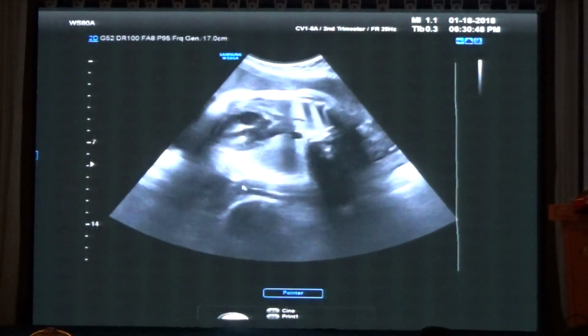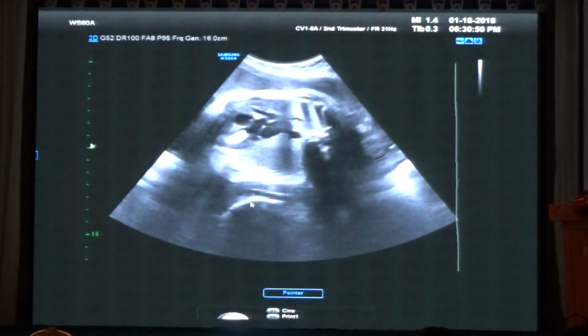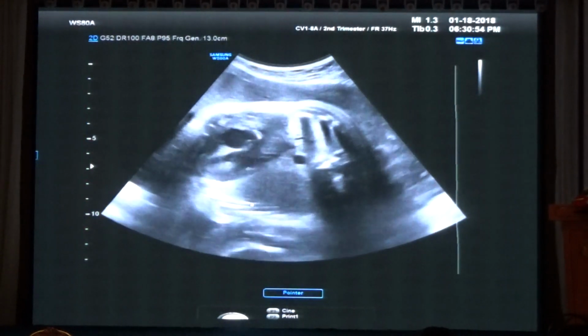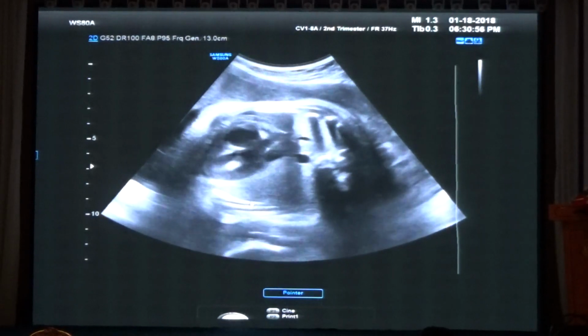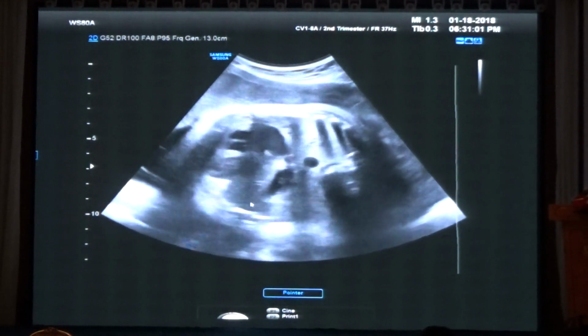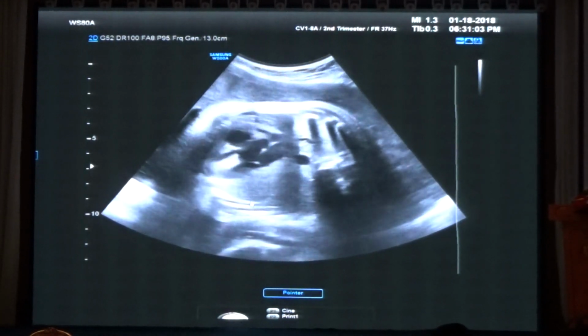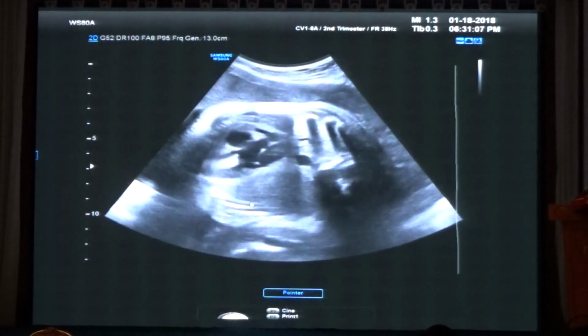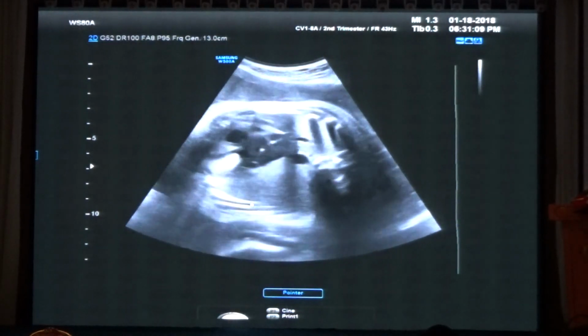Once I have done that, I don't need to see so deep anymore. So now I'm going to decrease the depth to use as little as possible. And also I try to decrease the width of the beam so that we don't have the machine calculate a lot of things. Yes. So how do we make it narrow a bit more? Good, perfect.